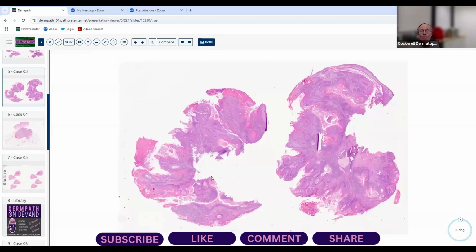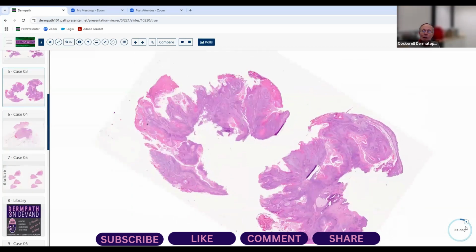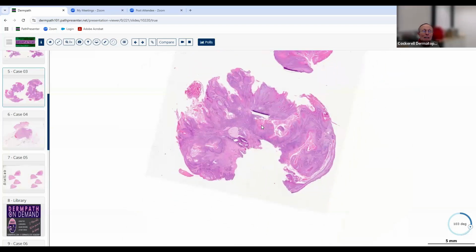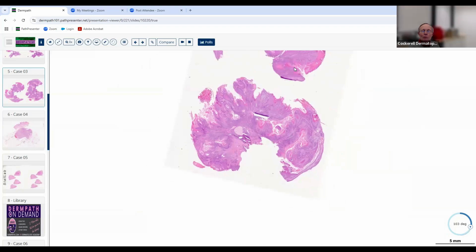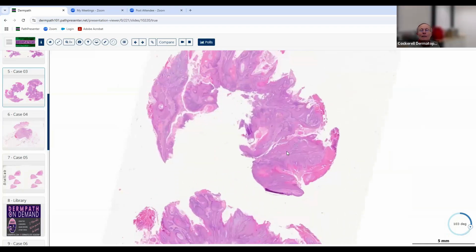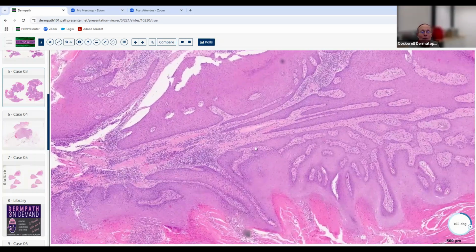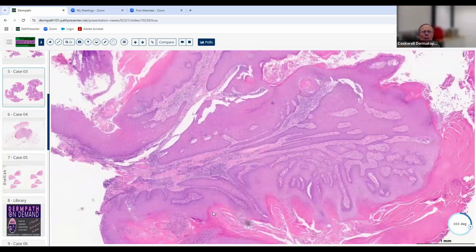Now, just so happens, we've got a similar kind of phenomenon here, and I just mentioned this to you a second ago, interestingly enough. We've got a dome-shaped papule this time that's also quite symmetrical, very well circumscribed, so we favor a benign process here, and epithelial. As we go to higher magnification, it's got a lot of verrucous epithelial hyperplasia.